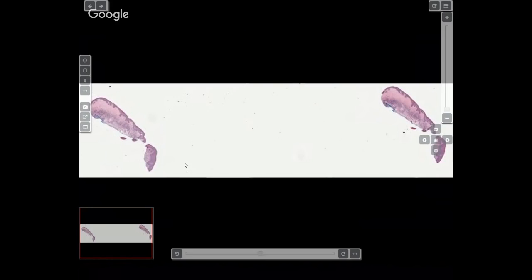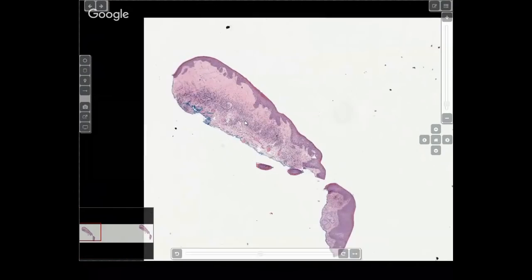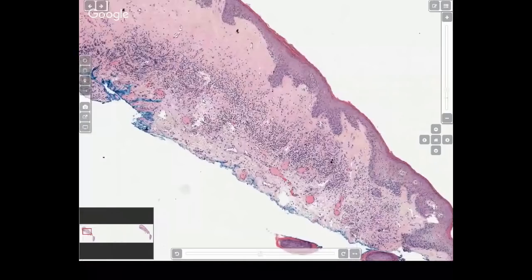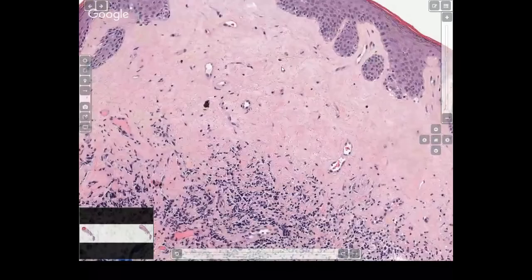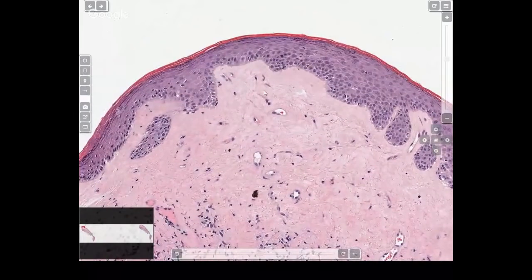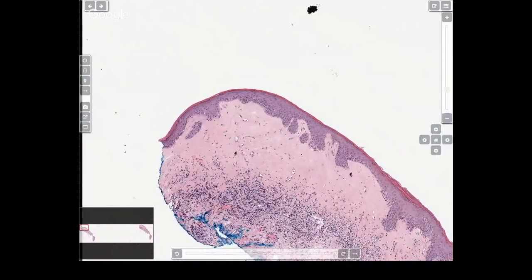When you look at the histology, you again see the lichenoid infiltrate, but now the lichenoid infiltrate is not hugging the dermal epidermal junction. And very classically, you're going to see the sclerosis. This is the sclerosis part of lichen sclerosus. So what you see is atrophy of the epidermis, and then very nice sclerosis, or very pinkish hyaline areas that are very smooth looking at the dermal epidermal junction. And this lichenoid infiltrate tends to be pushed down by the sclerosis.